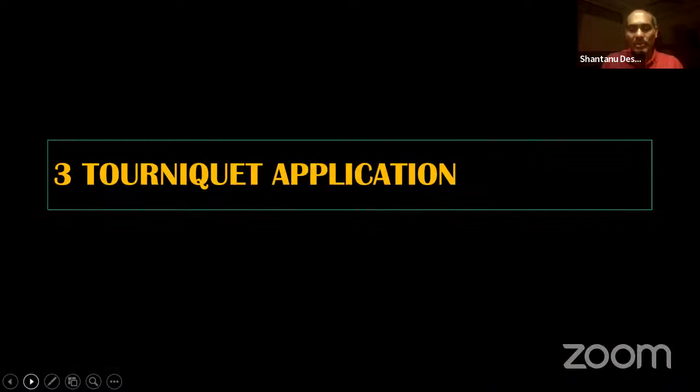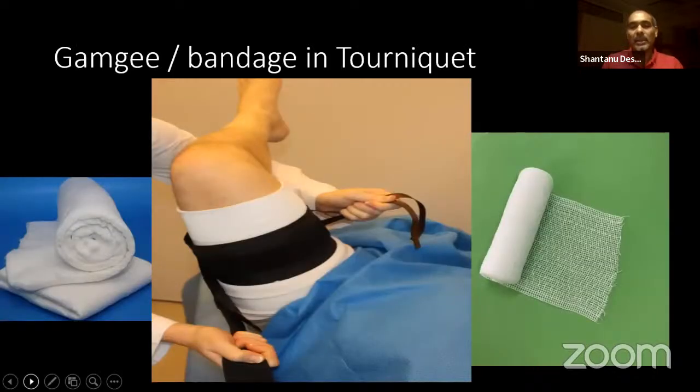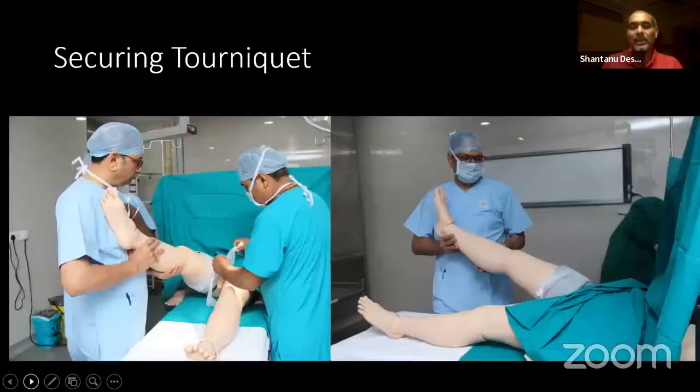Now, most of the orthopedic surgeries require a tourniquet. So it is very critical that your tourniquet application, as a preparation towards a good surgery environment, is done well. We use gamgees and bandage under the tourniquet, but the width and length of the tourniquet are both important. You have to make sure, looking at the circumference of the thigh, which tourniquet is to be used. If you think that the tourniquet is smaller, don't just put it on too tightly and use it. It's better to get another one and use it properly. Get one assistant to hold the leg, one assistant to wrap the tourniquet properly, making sure that the gamgee or cotton that you use is wrapped under the tourniquet.